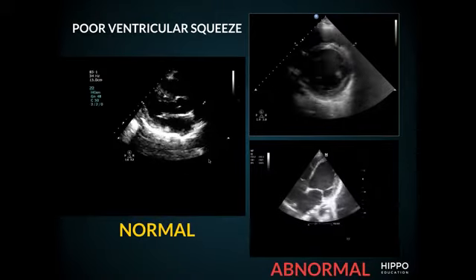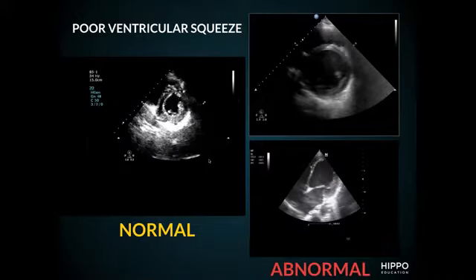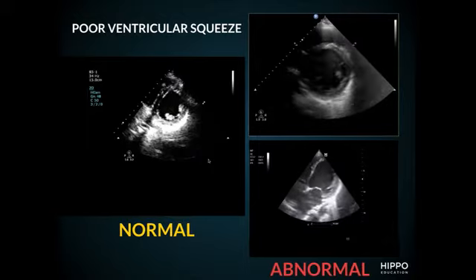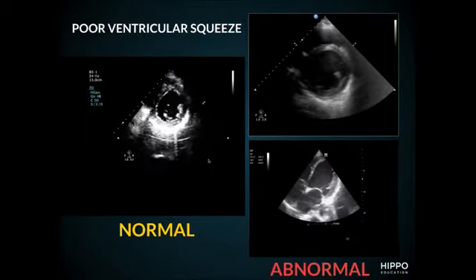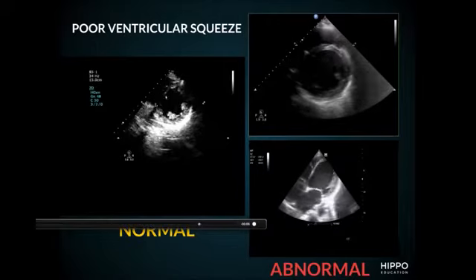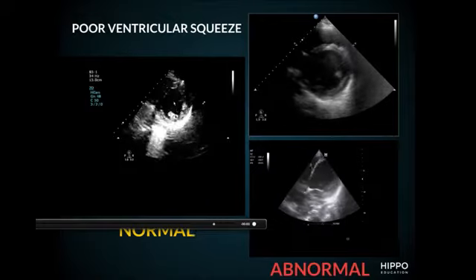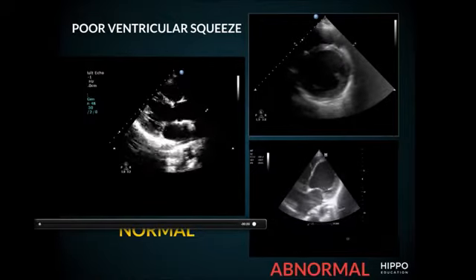And mostly what I'm looking for is how is the function of the muscles of the heart doing at pumping. What I want you to notice on the normal, it's looping between a parasternal long and then it converts to a parasternal short of the left ventricle. So this is the short. You can see this is the left ventricle and the musculature. That's some of the papillae, the musculature that helps hold the valves together, and this is the long.